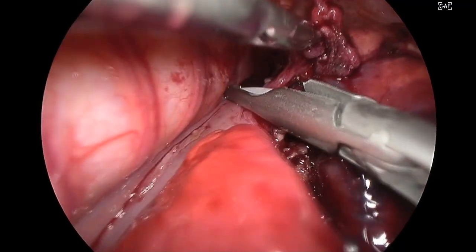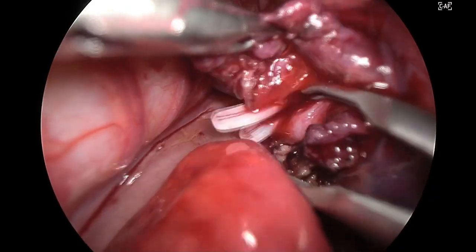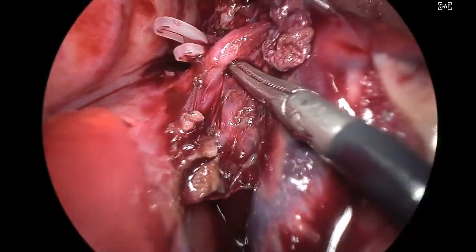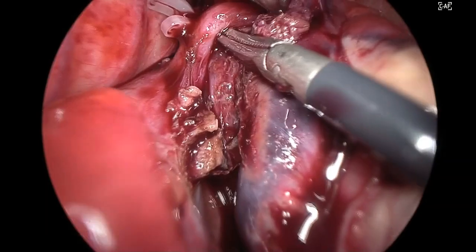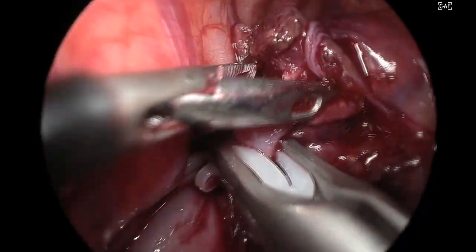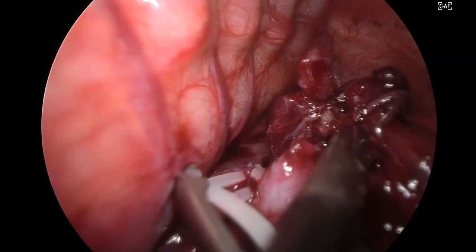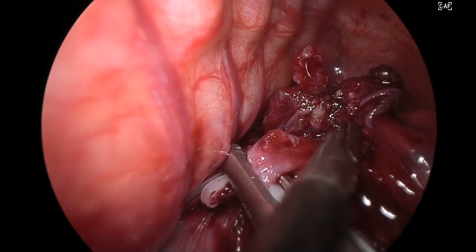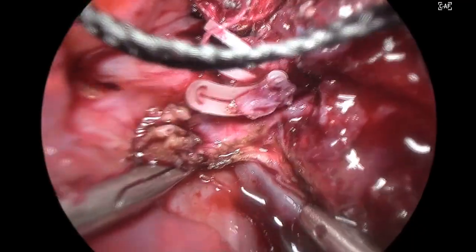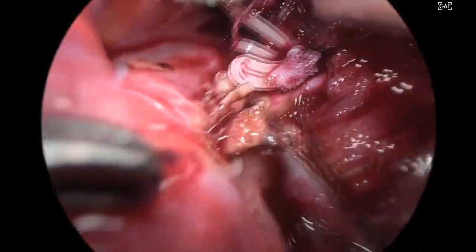So after dissection, applying two hemolocks, and then we'll divide this bronchus. Now we are dissecting the other division of the bronchus, which is again clipped, and then it's divided. You can again appreciate some degree of oozing which is there because the arterial supply is still on and the vein has been divided.